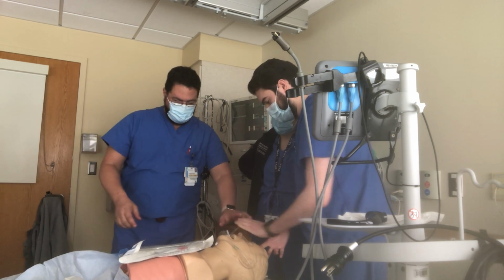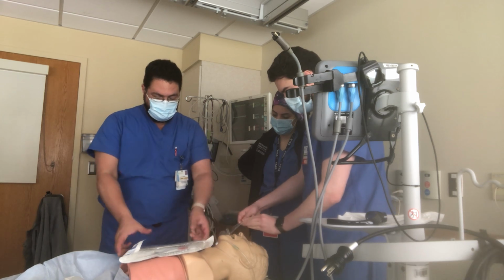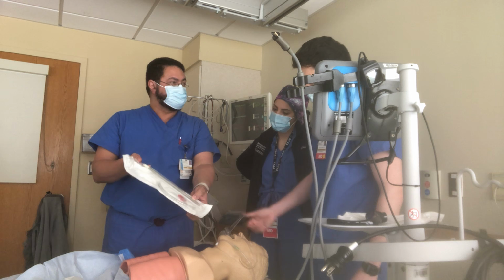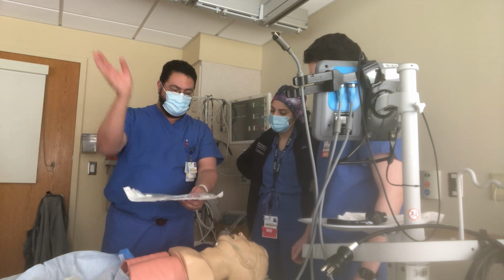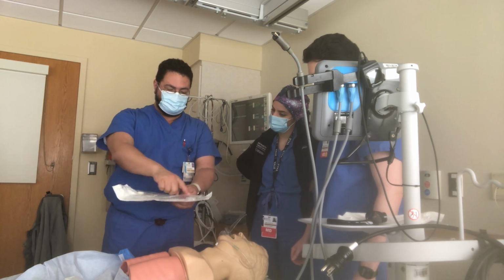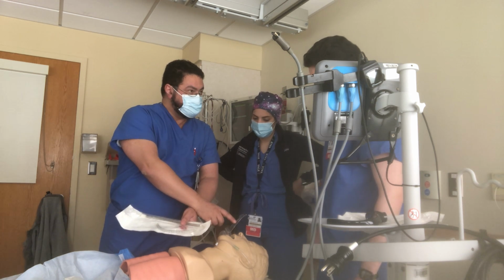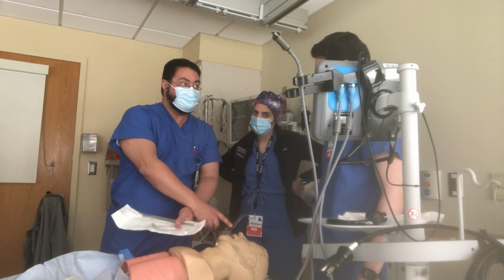And this one, yeah, perfect. And then we inflate this, and then through it we put this tube, right? We don't have time, but we're gonna put this tube. This device here is used by the anesthesiologist a day later to remove this. But acutely, if the nurse tells you, please remove this because it's in the way, just say, what are you gonna say? No.